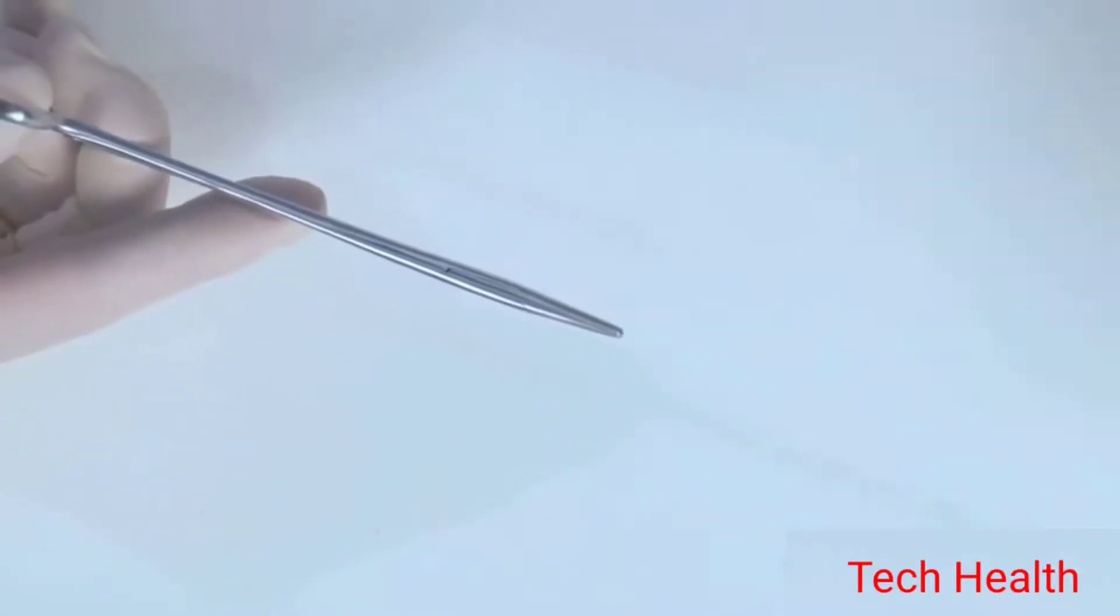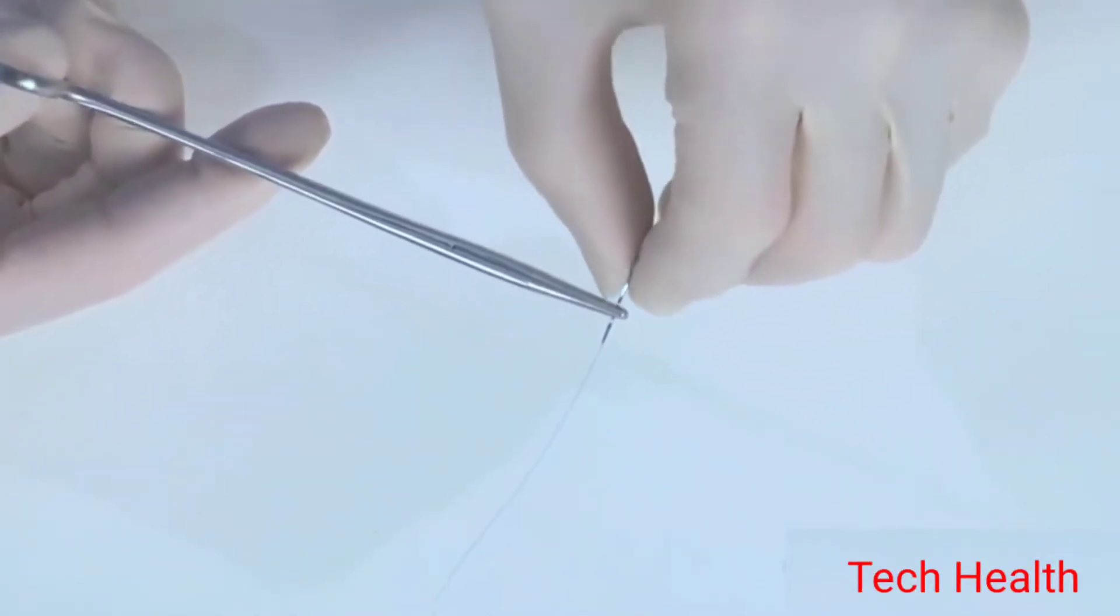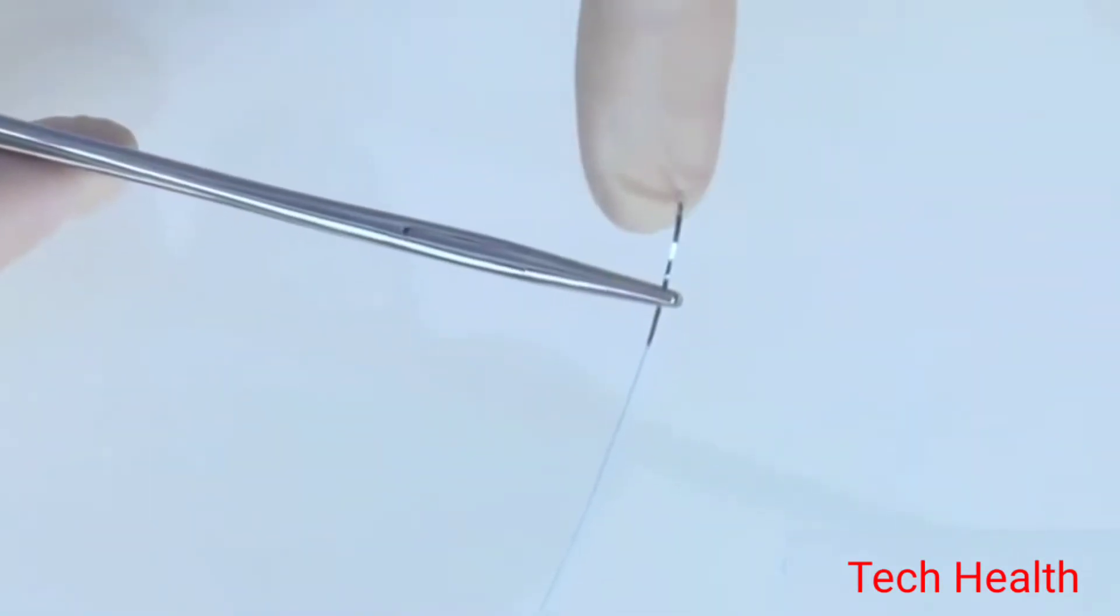In order to practice a tie, load a needle at a right angle and grasp it two-thirds of the way down. Hold the long end of the suture with the needle on it straight up from the point where the suture was placed.